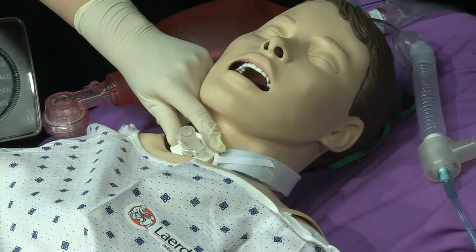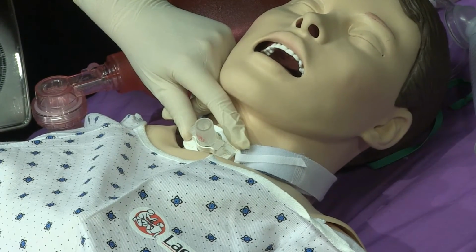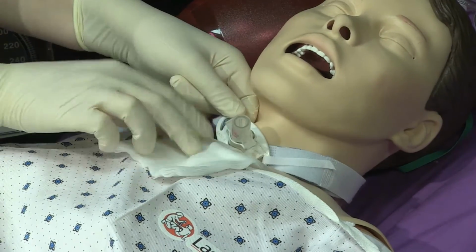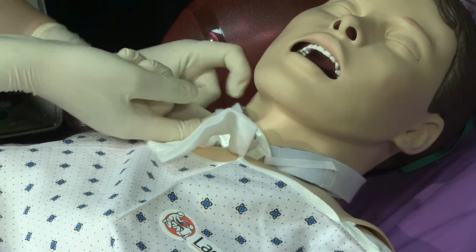Apply bifurcated or folded 4x4 gauze to tracheostomy site. Gently lift one side of the faceplate to insert the gauze and then repeat on the other side.